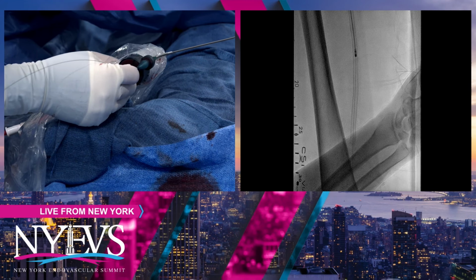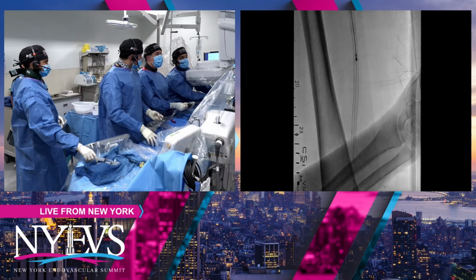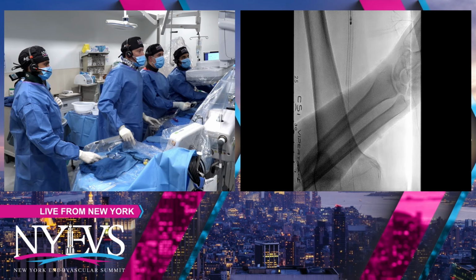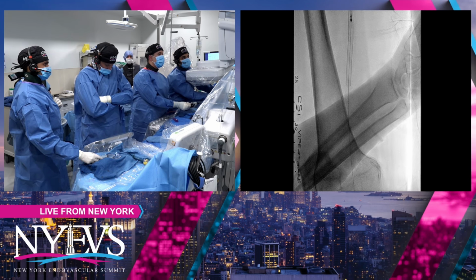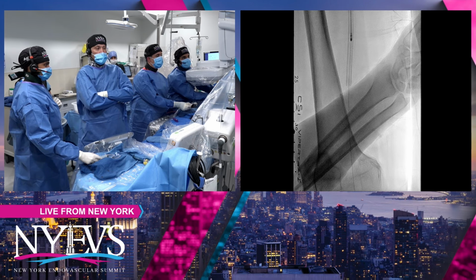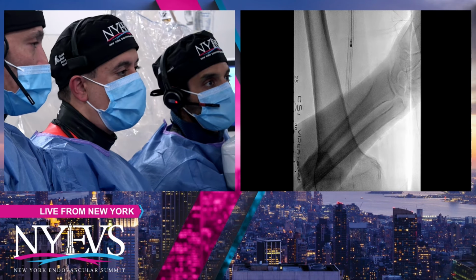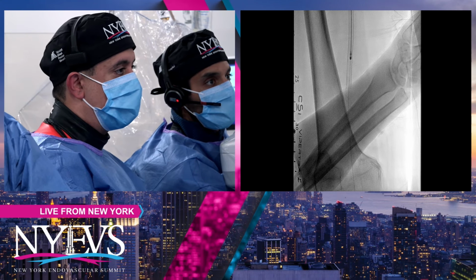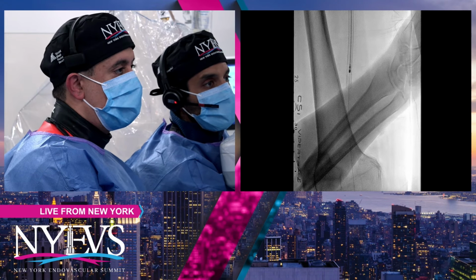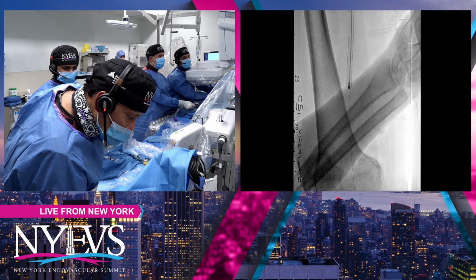When you guys started, when you saw the lesion and you saw this, what were you already planning for definitive treatment, Michelle? We discussed among ourselves, and like you rightly said, the proximal part definitely needs a little bit more aggressive therapy. So we were thinking of just using a drug-eluting stent in the proximal part. Distally, our goal was to do a drug-coated balloon. We're going to do a drug-coated balloon of the entire stent anyways. But for the distal, new de novo lesion, we plan to do a drug-coated balloon and see how it responds, and only if we have to, extend the stent down into the popliteal. The idea is to try to keep that vessel as scaffold-free or stent-free as possible. Let's say for a future bypass if this fails, with a long stent, which everybody knows the chances are definitely higher, then we should probably have the option of doing a surgical bypass versus detour, whatever people like to do based on the indication.